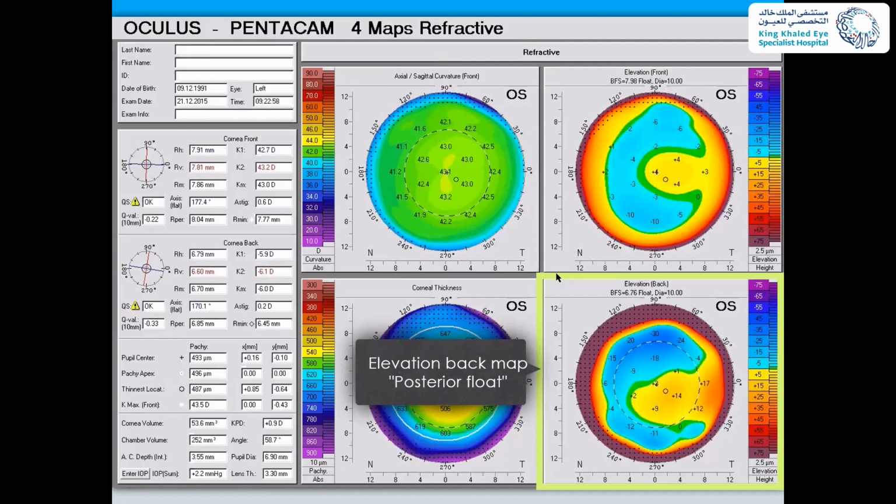Dr. Ahad, this is Mohammad Ahad again. You talked about the topometric indices for keratoconus. I saw some physicians in their presentations who have data about predicting the visual gain after some procedures that they will do, such as intrastromal rings. Are they that accurate now, or are there only a few reports of that?